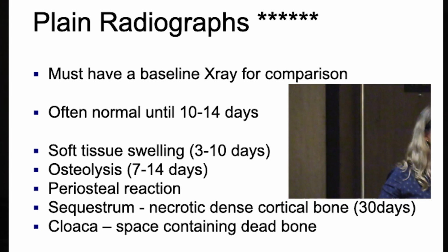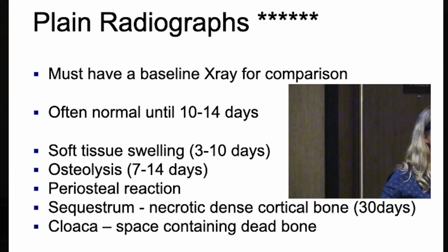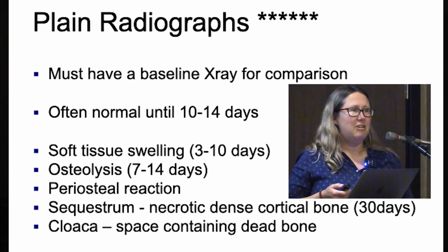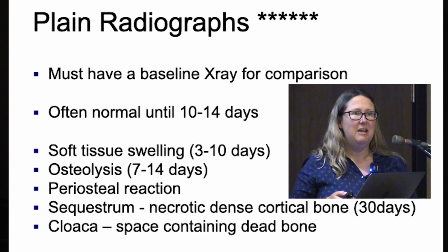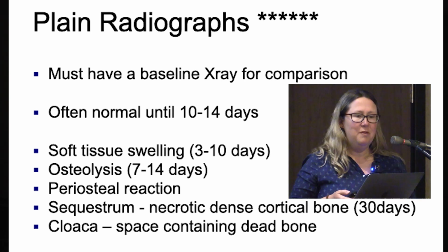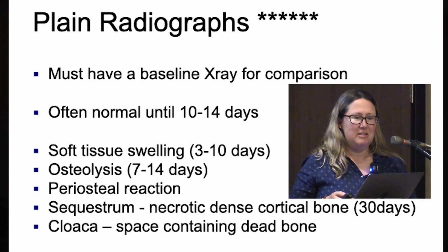When your patients come back, as they inevitably will, to your clinic time and time again, you're not going to get a fresh MRI every time they come, unless you work somewhere that I'd like to work. You're going to get an X-ray every time they come, and that's what you're going to use for your comparison to see, is the condition deteriorating or is it healing? So please, you must get a baseline X-ray. I know they're often normal for several days, for several weeks, until you start to see the signs that you're all going to be very familiar with.